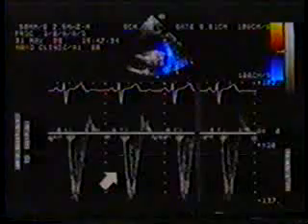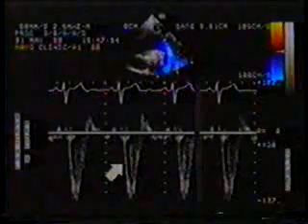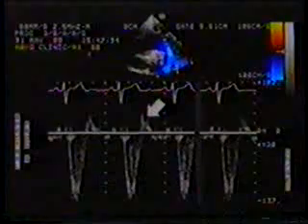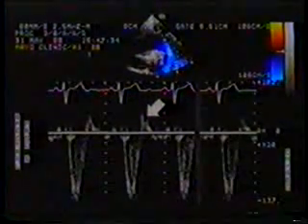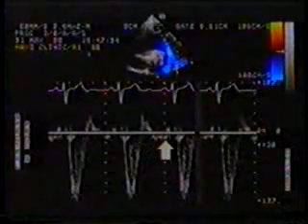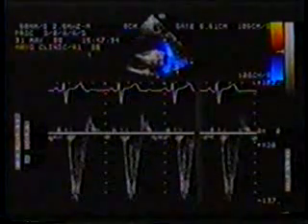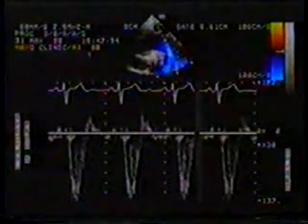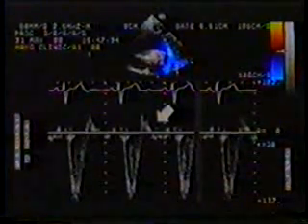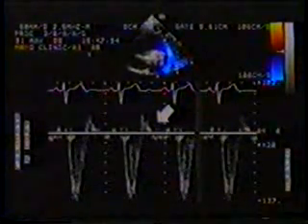This is the resultant pulsed wave spectrum. Systolic flow is recorded below the baseline. In early diastole, there is a brief signal above the baseline due to a physiologic amount of flow reversal. The remainder of the diastolic signal is below the baseline, indicating that the majority of diastolic flow is in a forward direction. Patients with mild aortic regurgitation might show this same pattern. We have not found this portion of the Doppler examination useful for separating normals from those with mild aortic regurgitation.